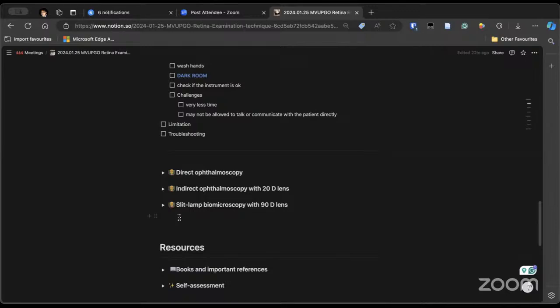So when you go there, like I said, you try to identify the refractive error right from a distance. Because from a distance, with your naked eye, you might be able to at least guess that there might be aphakia. The problem is with high myopia, aphakia or very high hyperopia. If they are given, the clues will lie in your examination with the naked eye and the distant direct ophthalmoscopy. When you are doing distant direct ophthalmoscopy, the Bruckner reflex will help you in finding the refractive error.